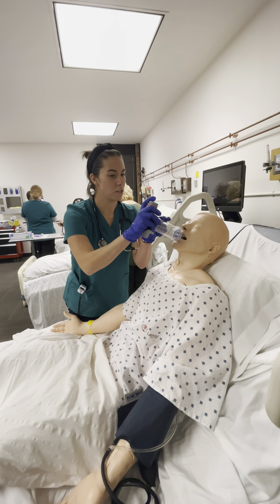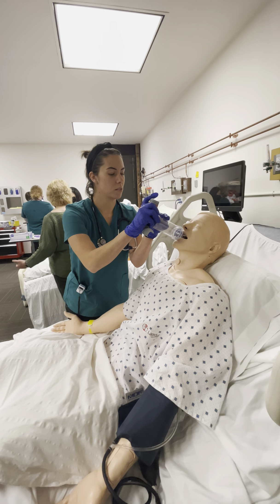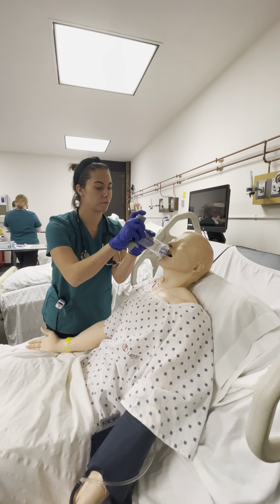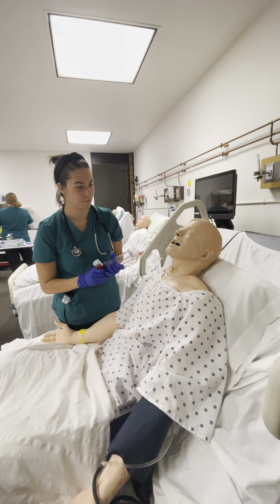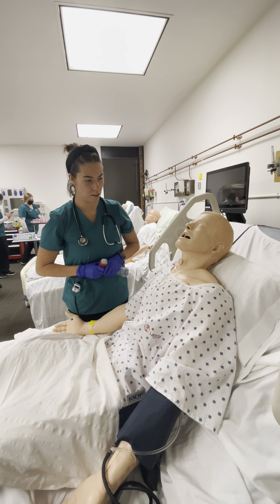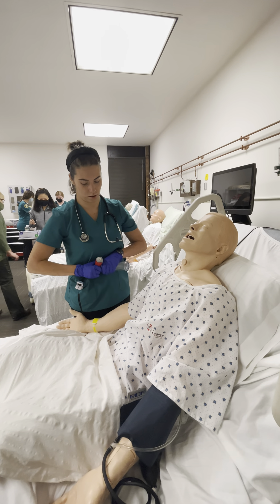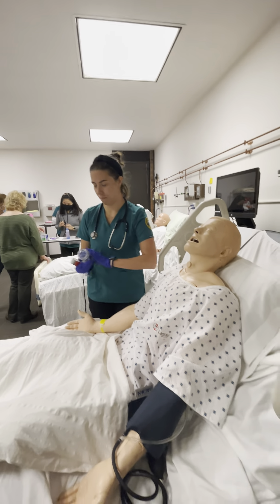We're going to go ahead and breathe in slowly. I'm going to press the canister button. Go ahead and breathe in slowly, then hold the breath for about five seconds. Go ahead and let it out. How do you feel about that? Do you think you can do that at home? Perfect.